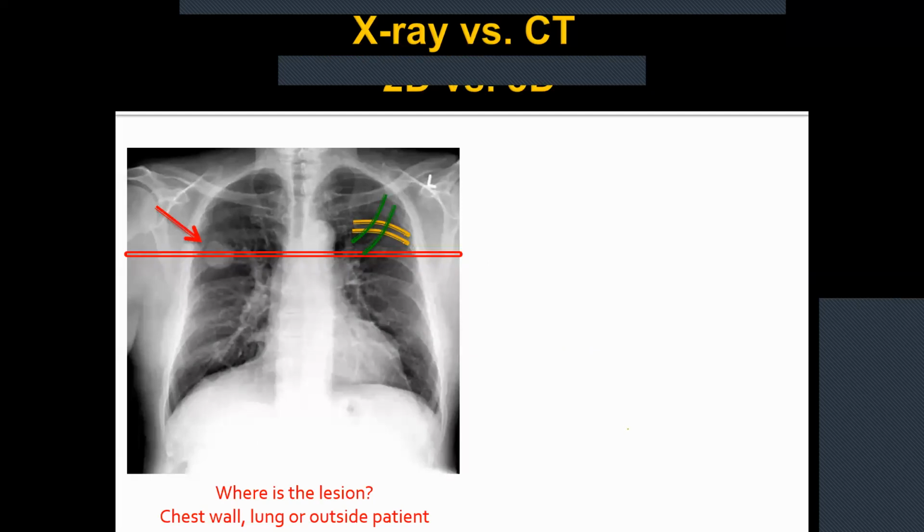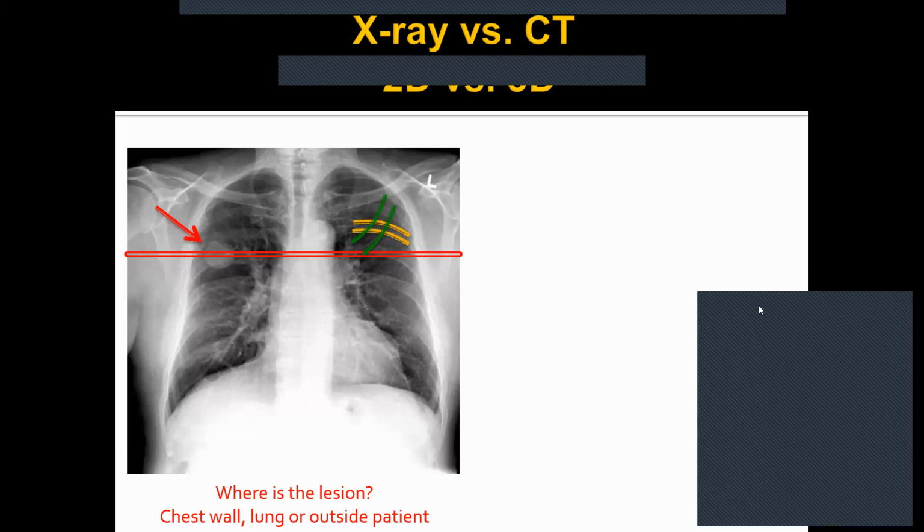All right, sure. So the main idea for kVp is that when you have a higher kVp, the electrons are going to have more energy. And so when the electrons have more energy, the X-rays will have more energy. Okay? And so when the X-rays have more energy, they're going to pass through the patient more. And so what that means is that you're going to get a lot more X-rays that will reach the image, and so that can improve, in theory, the image quality.